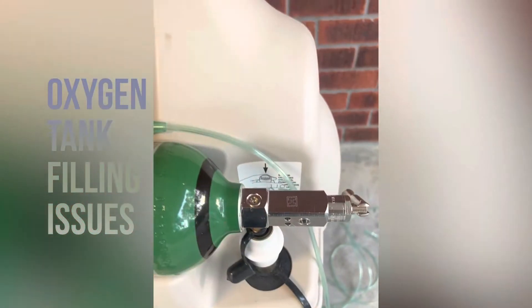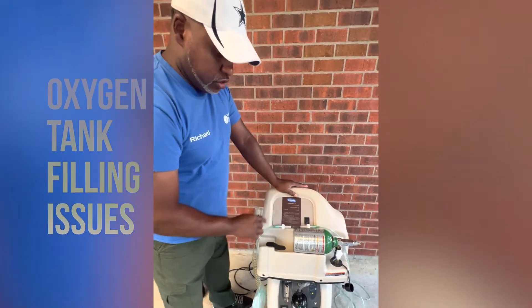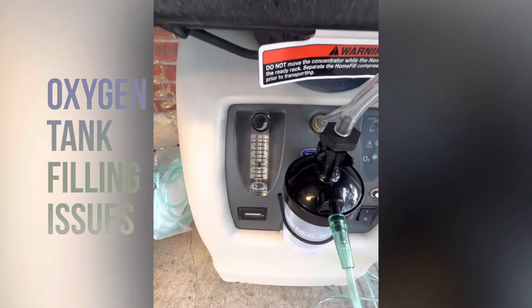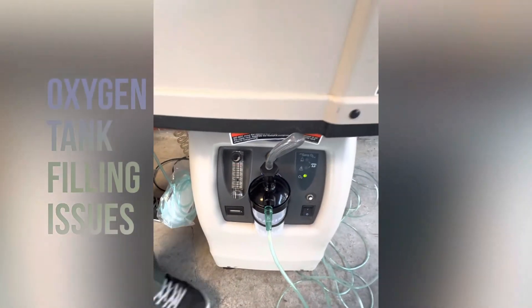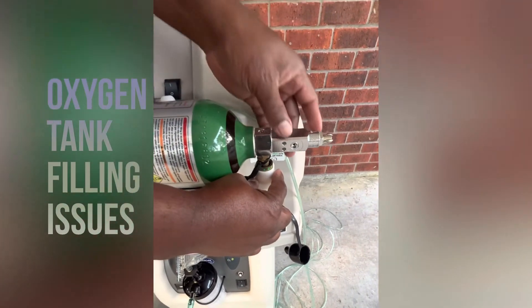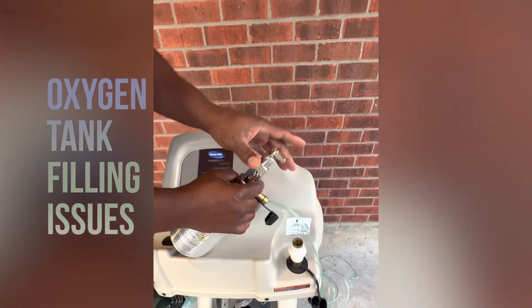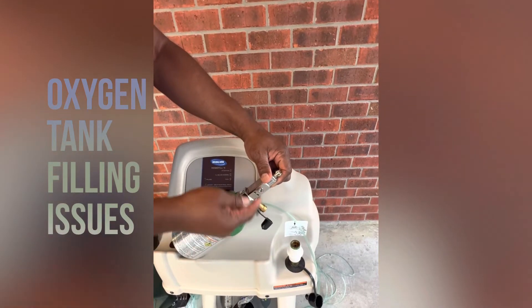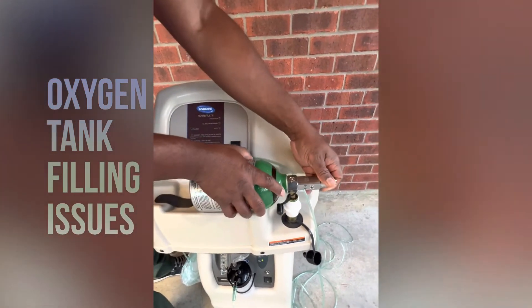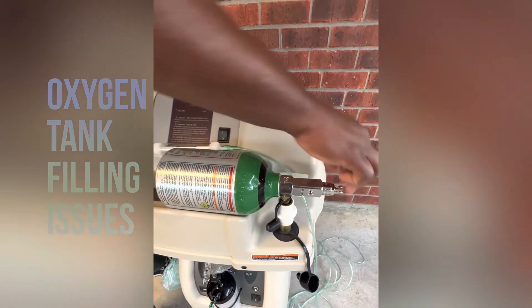So you said it's not filling — those are some of the things to check. Make sure you're under two liters on your liter flow, and make sure your tank is seated down inside the nozzle correctly. One other thing we didn't mention: make sure the bottle valve is closed. Your tank has to be closed, because if it's not, oxygen is leaking out of the ports and the hose. As you're filling, if the tank is not closed, it's seeping and it's not going to fill.